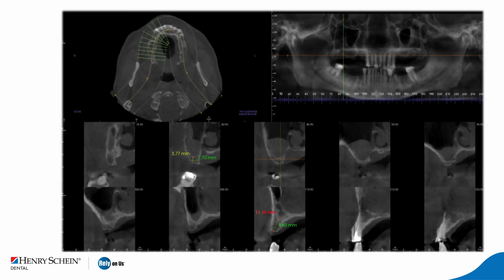Okay, that means trouble. And if you look back on one of the slides where measurements were made, this one is still on the right side of the maxilla. You can assess that there is also a lot of thickening within the sinus and within the nasal fossa. So you see that thickening of the mucosa. You see that there is disruption of the floor of the cavity, and there are erosive changes occurring there. Okay. It means that the floor is disrupted.